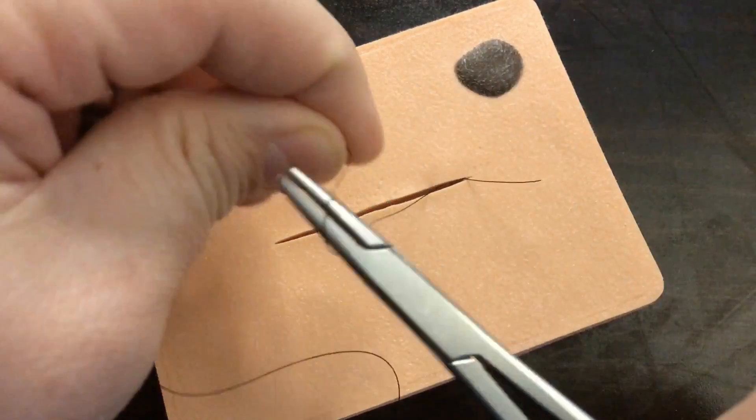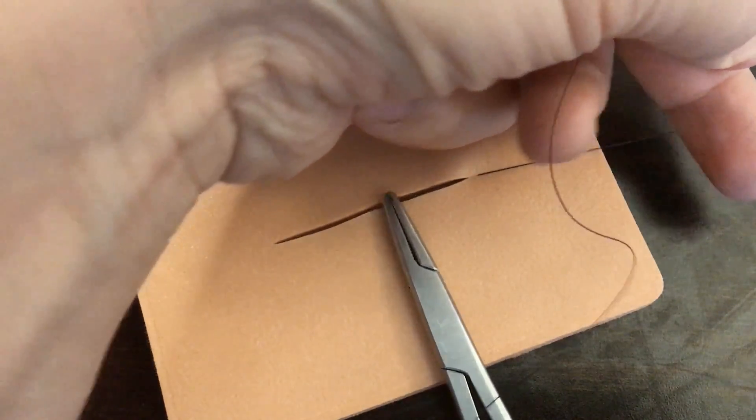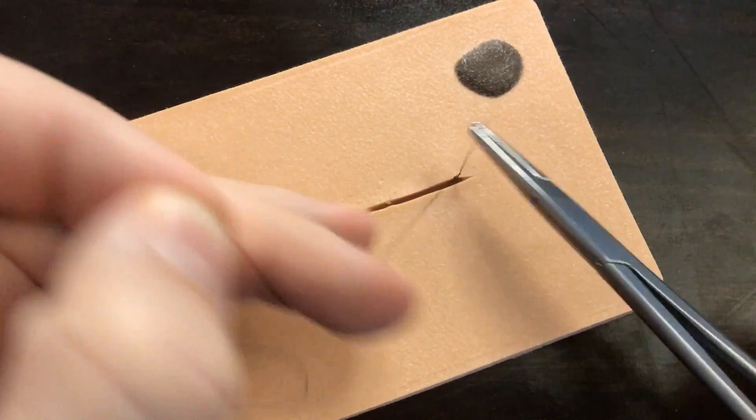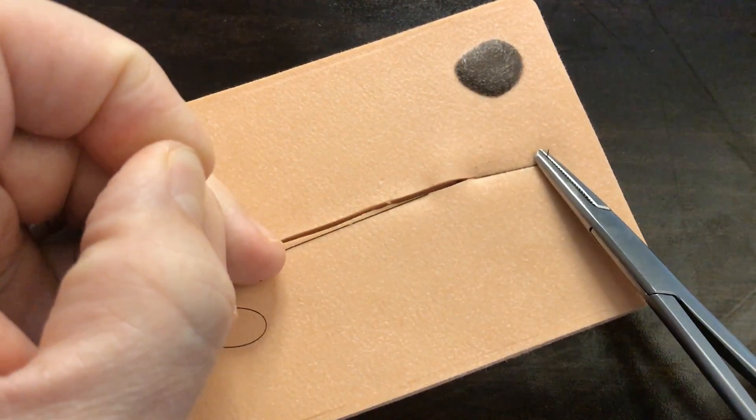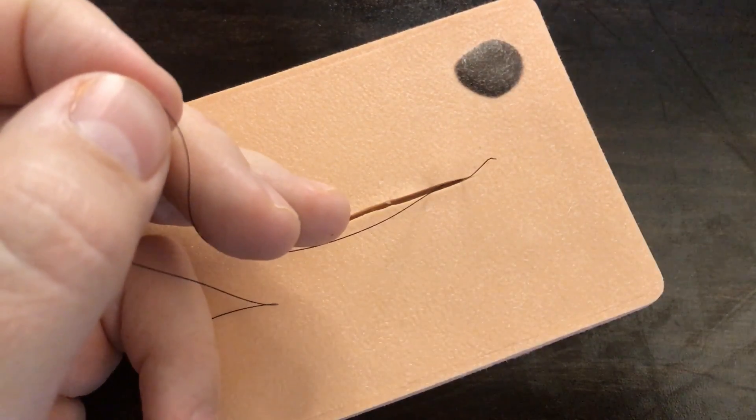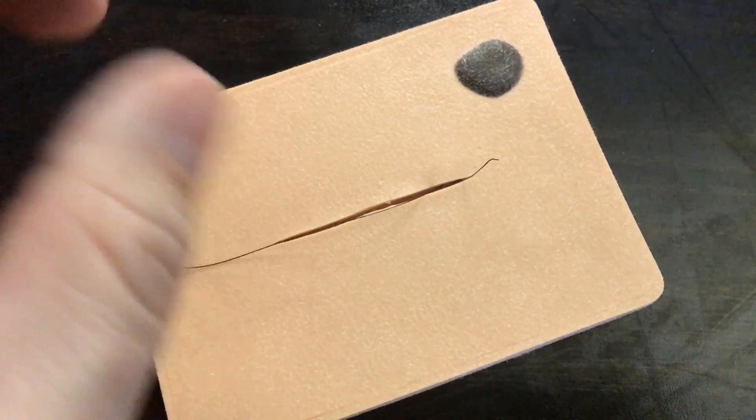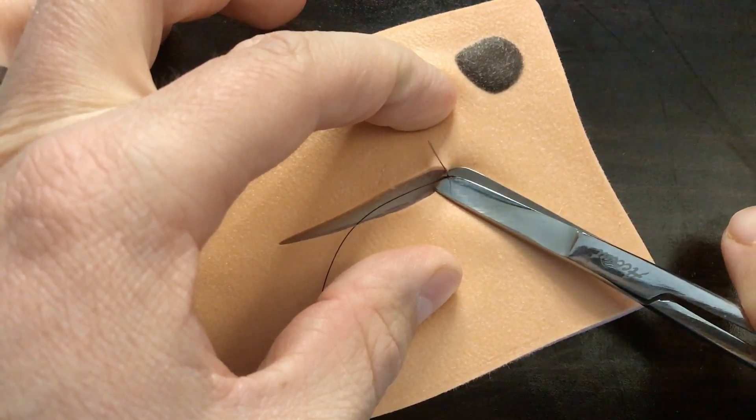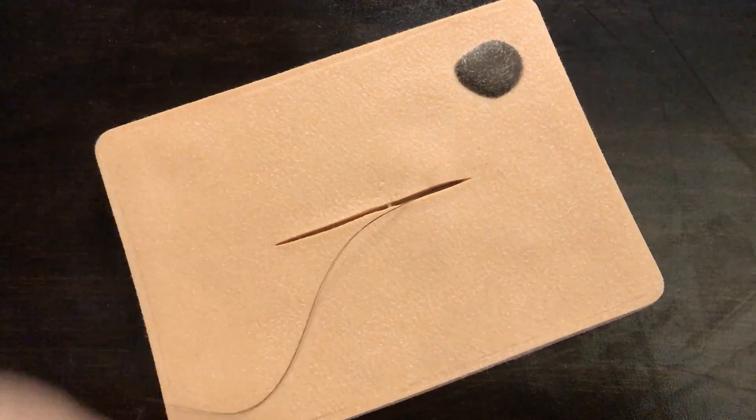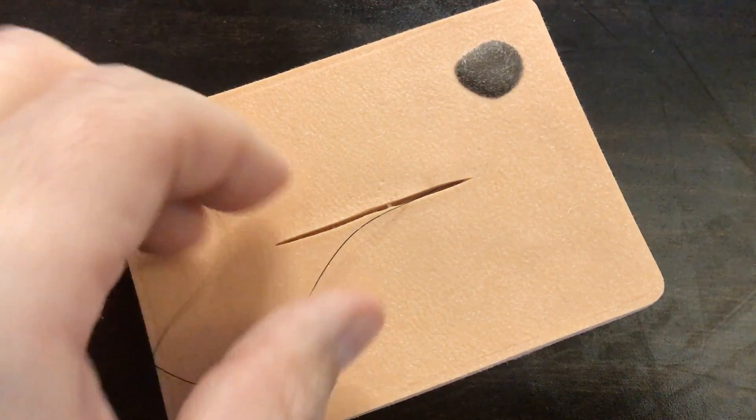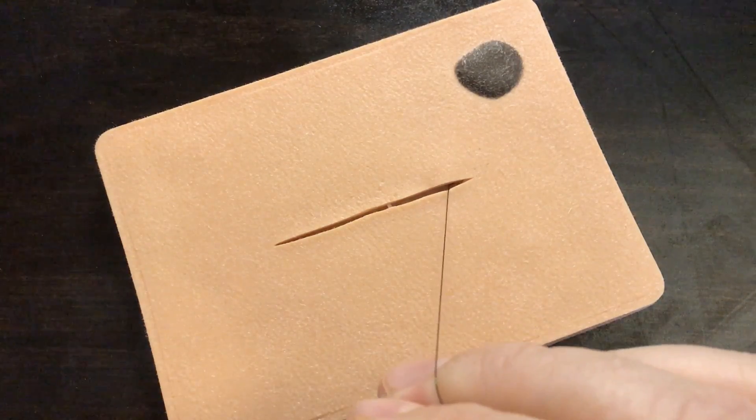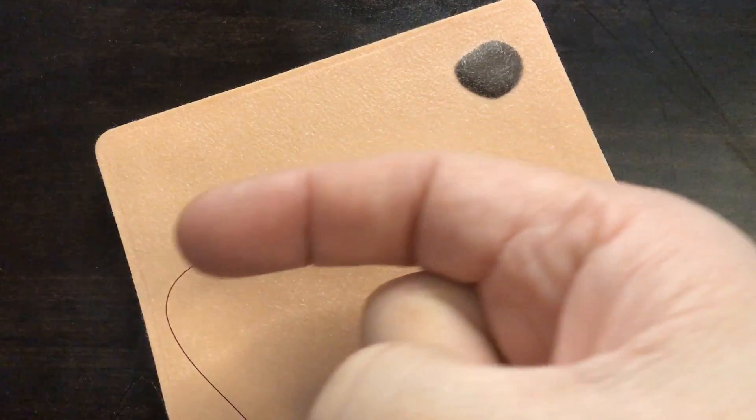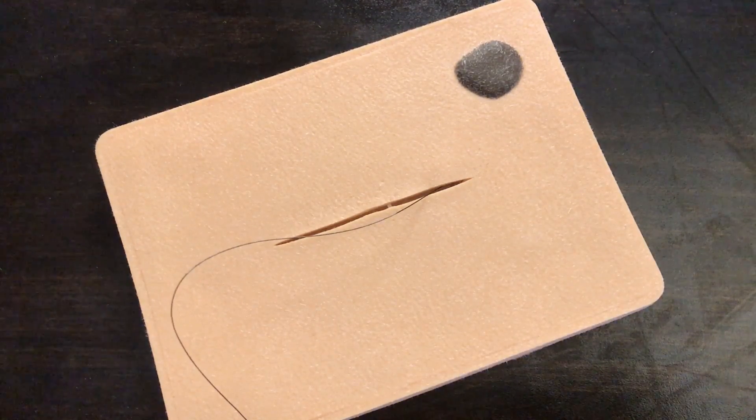Notice how I'm kind of pulling my tails back and forth with the laceration rather than apart because I'm in the depths. So I'm pulling this way rather than this way, so I don't want to cause any skin edge damage that way. Now because this is a running suture technique, I need to keep obviously my side with the needle attached still intact, and so I'm just going to cut one tail and I want to make sure that tail is not very long so that it's not sticking up through the skin as I move forward. So there we go. We've got suture anchored in the depths of this wound near the apex and on the right side because I'm going to be going this direction as a running subcuticular continuous suture.